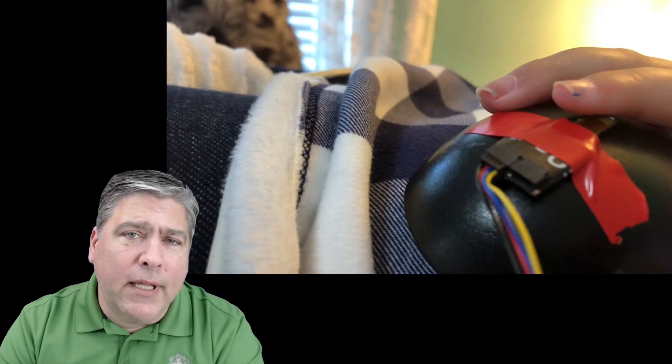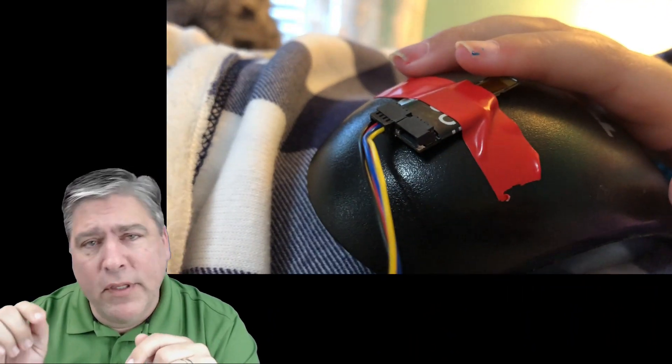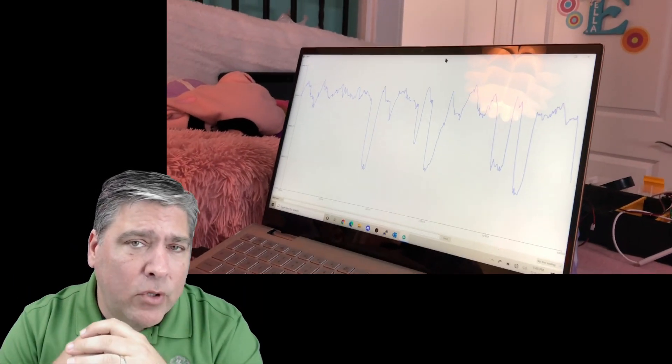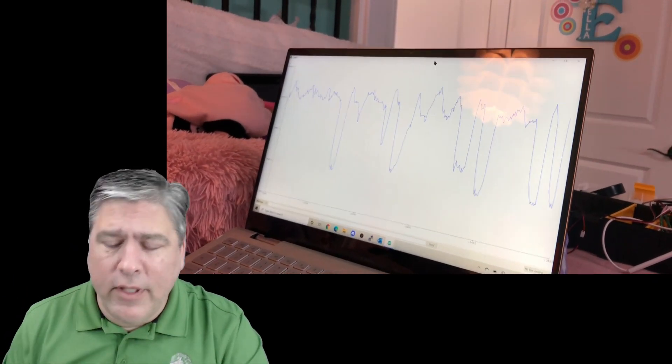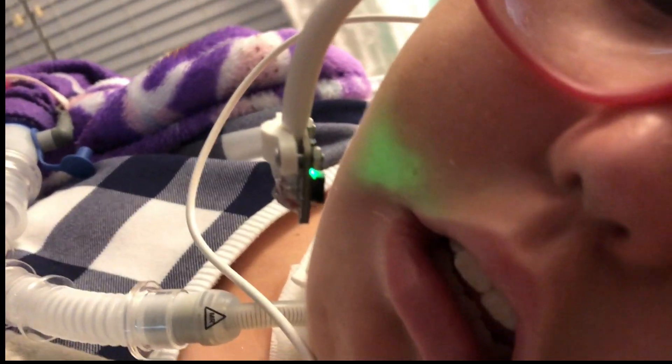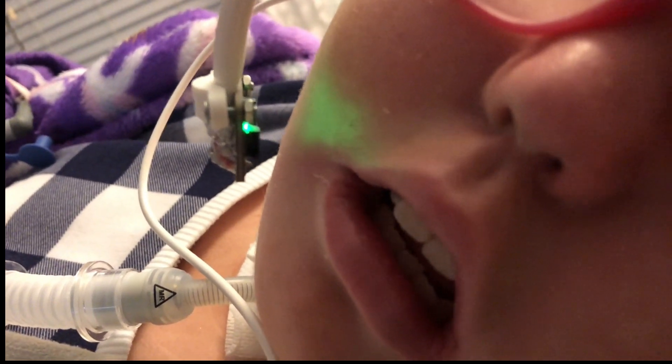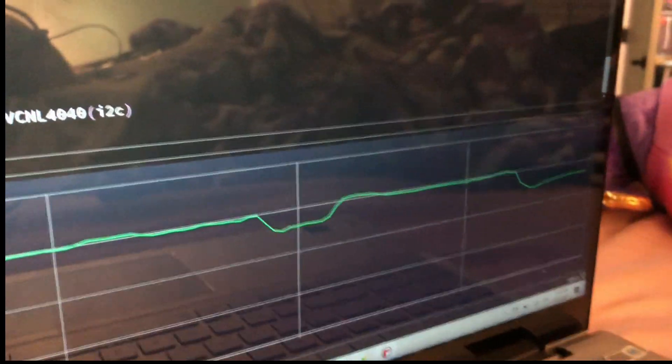We spent the afternoon with a system that allowed Ella to actually see what the sensors were detecting and help us position things — whether it was on her cheek or on her hand — so that she had the most amount of control. Currently it is looking at Ella's cheek and when she smiles, it gives enough of a difference that we can see it.